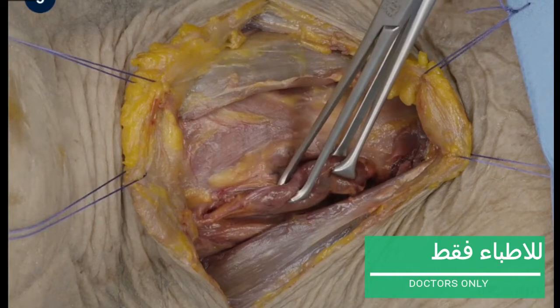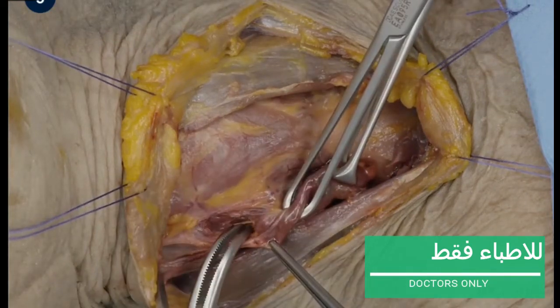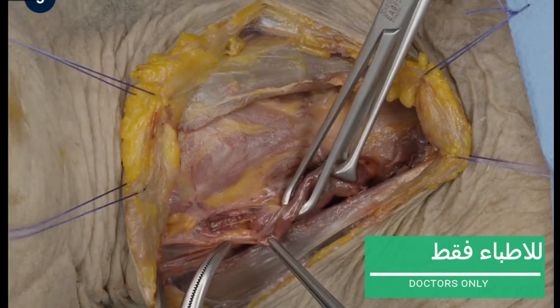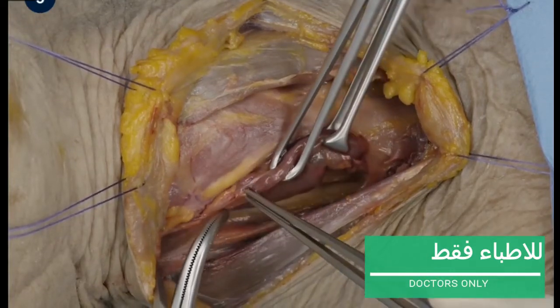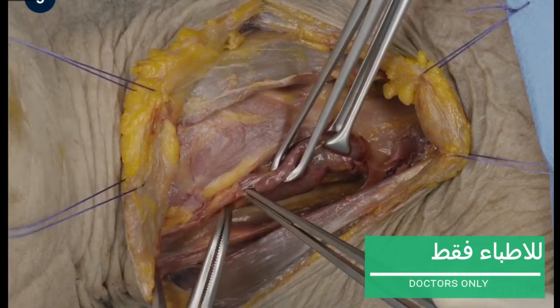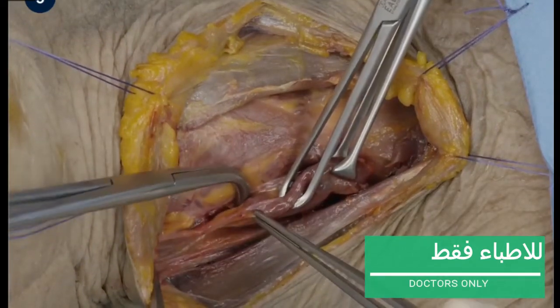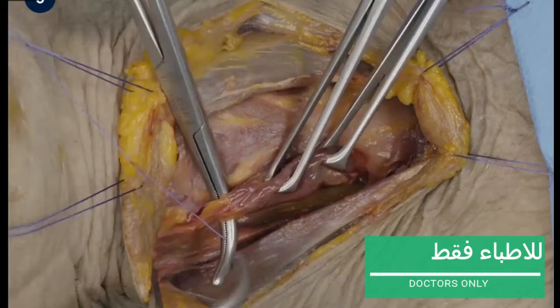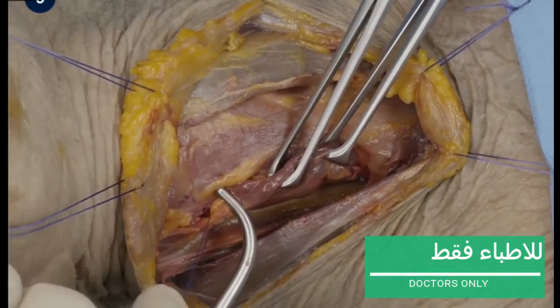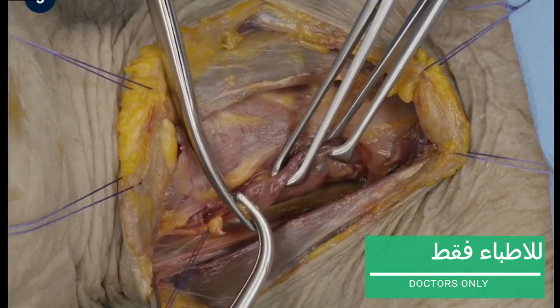The thyroid gland is grasped with Ellis clamps. The superior thyroid artery is identified. The superior laryngeal nerve is expected to run deep to the artery, and will be shown in the overview of the anatomy at the end of this film. The upper pole vessels are ligated close to the thyroid capsule.